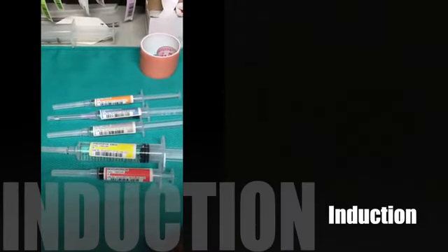Typically on the right side will be induction drugs. There's midazolam.